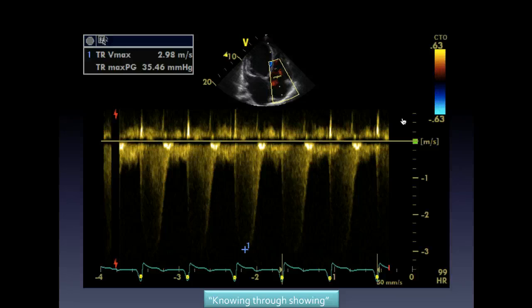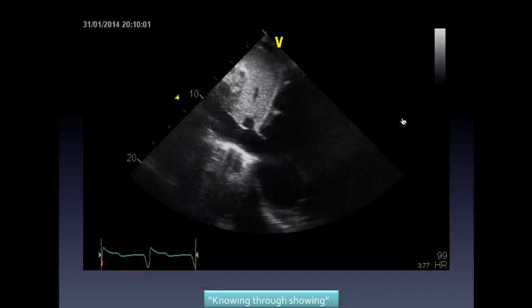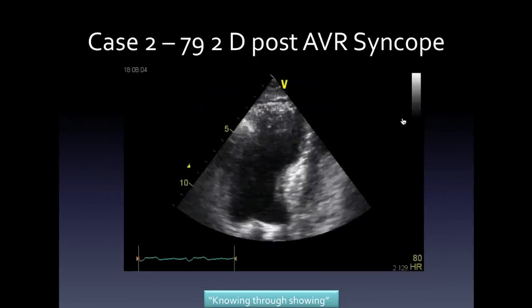But we're going to swan him anyway because I wanted to know the cardiac output, and I cannot estimate cardiac output without a swan. And I know they're non-invasive measurements. I'm getting some bizarre looks in the audience, but this guy was swanned, and his mixed venous oxygen saturation is 42%. Okay? So he's doing okay, but there's a lot of work to do. So that is just one case which was relatively straightforward because we had lovely pictures, we had single system disease, there weren't many flies in the ointment, and it became relatively simple to manage.